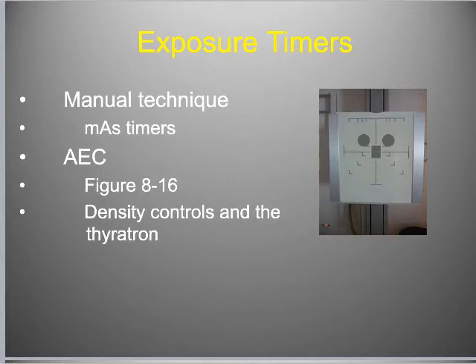What automatic exposure control does is this thing here that looks kind of like Mickey Mouse on the Bucky, right? Underneath each one of these little parts of Mickey Mouse's face is an ion chamber, right? That ionization chamber is registering how much exposure is reaching that little air chamber. You can't see it on the X-ray.